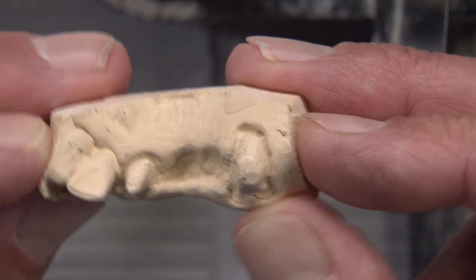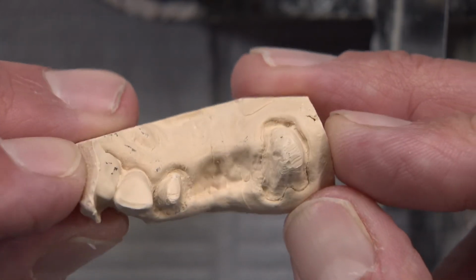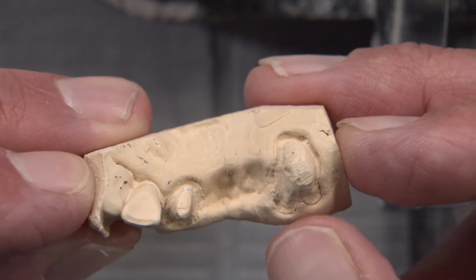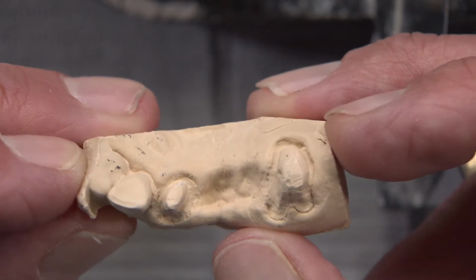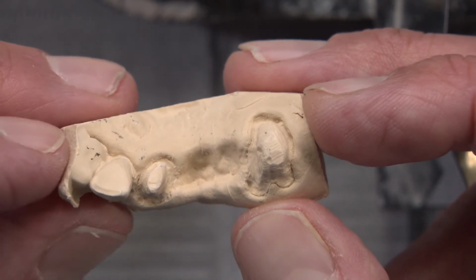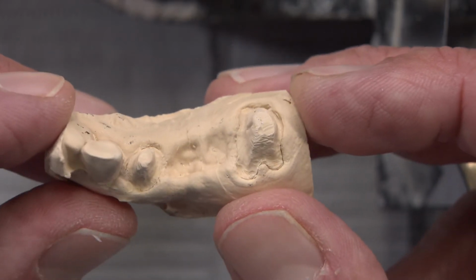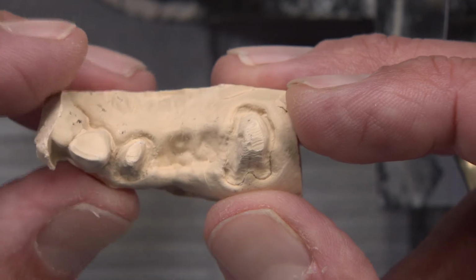Pretty much the entire buccal, from the mesial buccal line angle to the distal buccal, has space. Then on the bicuspid, just the tiniest of spaces right there, just a little bit on the lingual, and then you can see it just kind of blends in. And so our technicians end up doing a lot of guessing when they go to trim this, and they have to do that day in and day out, and we'll do it.